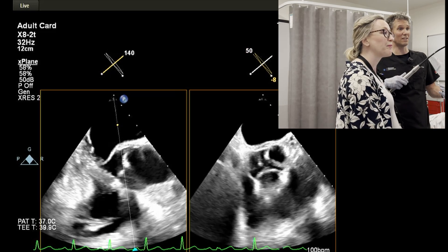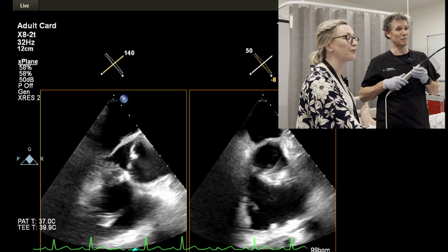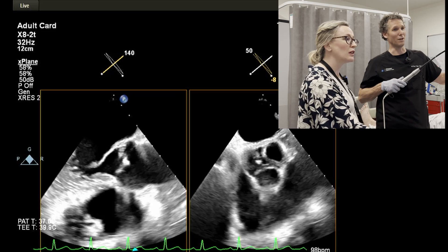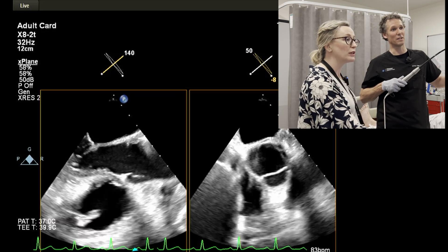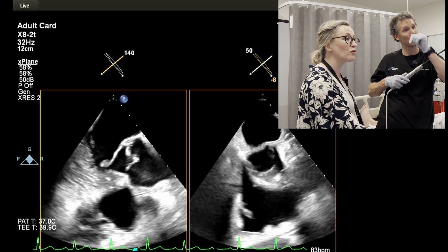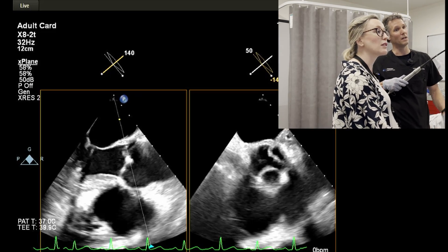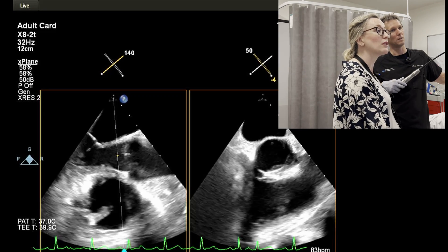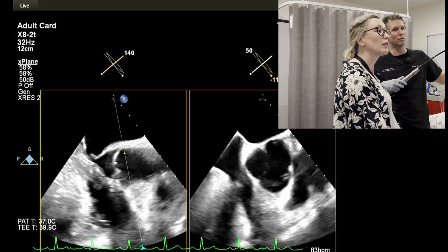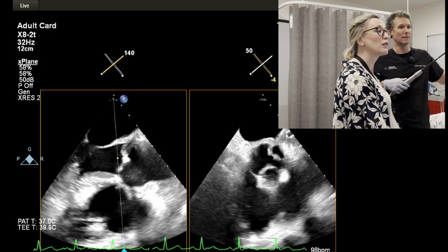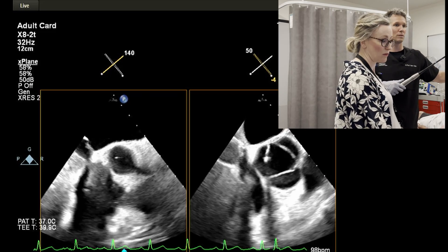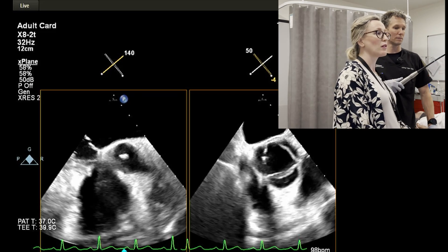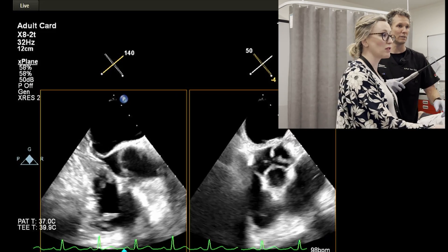Now we're doing this scan to have a look — it's a young gentleman who's had a stroke. I have to say, I don't think that looks entirely normal. Hang on, just go through the cusps of the aortic valve. Should we just do 2D? Should we just go to the short axis? Yeah, just go to the short axis.